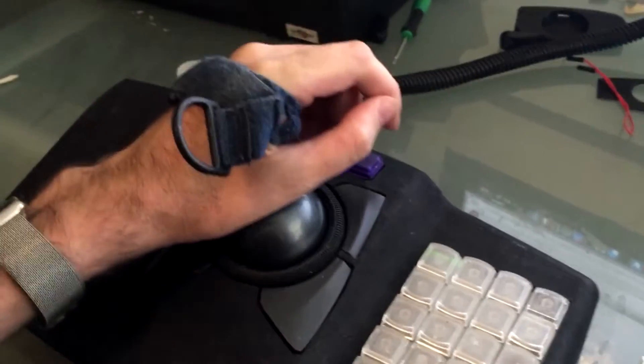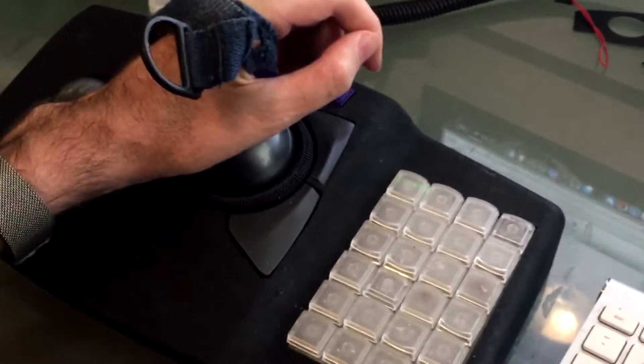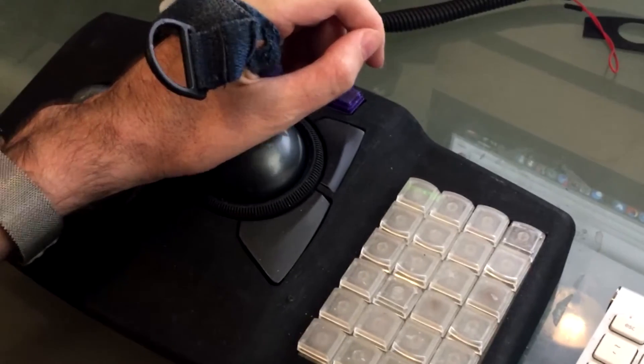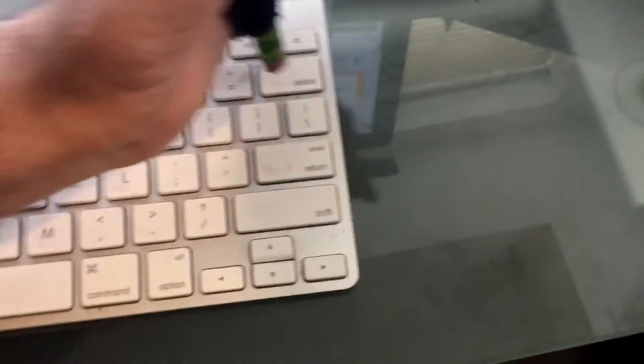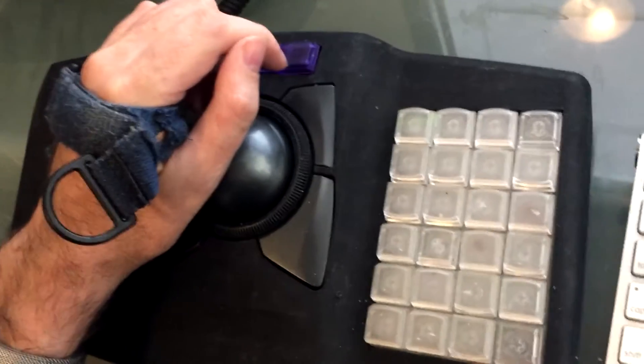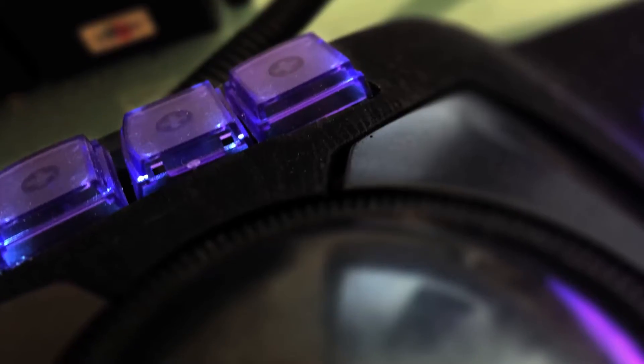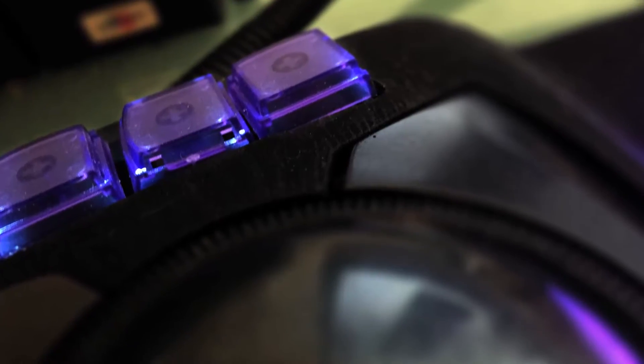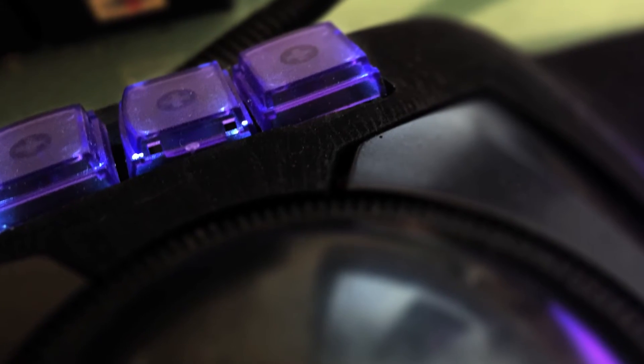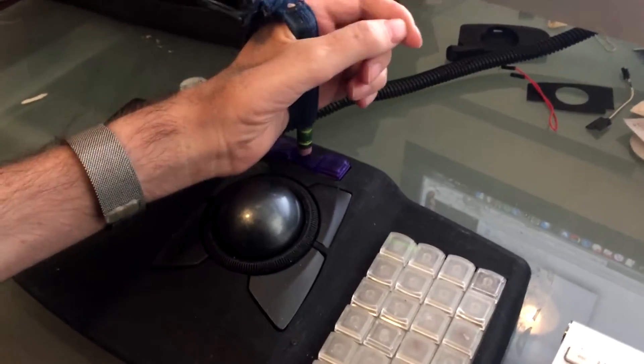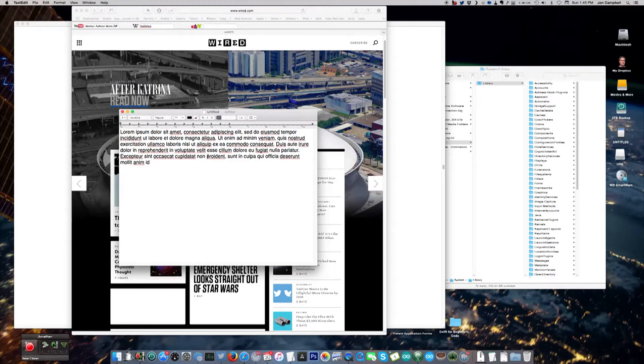I do all of my typing and cursor movement with my left hand using a pencil and a universal cuff. I found that I was reaching all the way across my keyboard to press return and delete. So most recently I added three keys above my trackball that serve as command, delete, and return buttons.